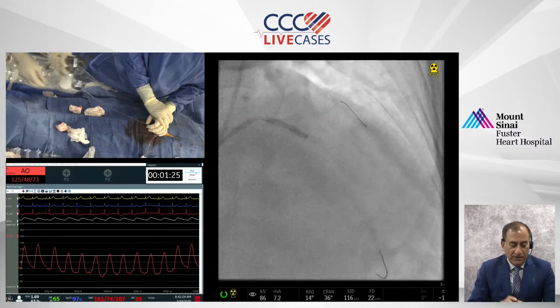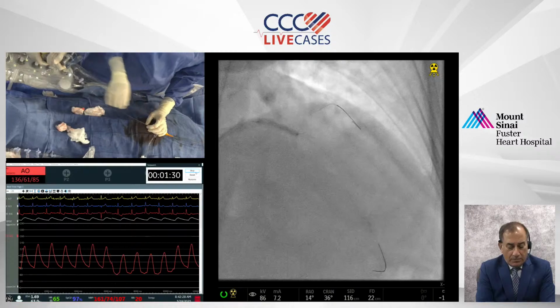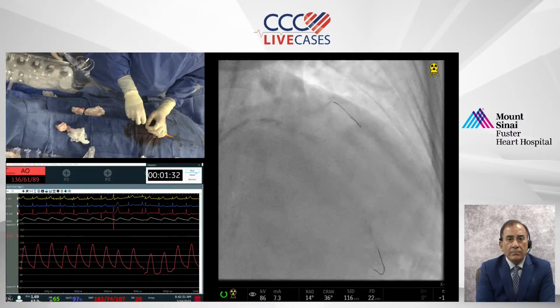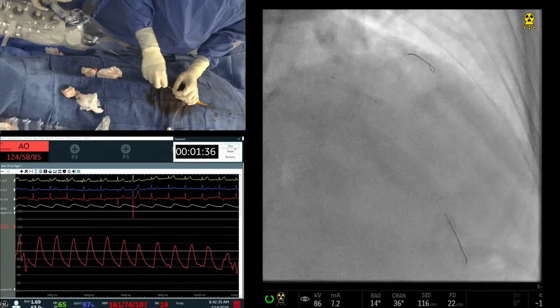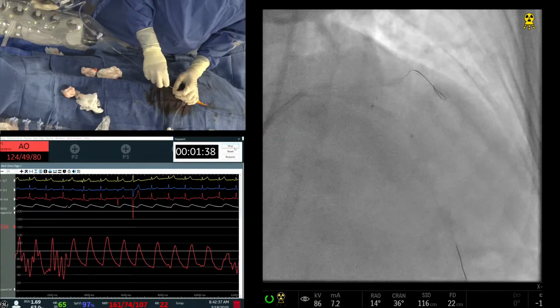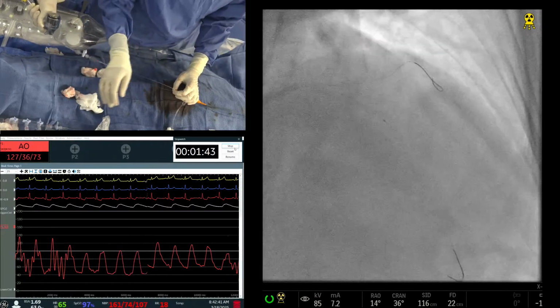Yep. So wonderful. We just recently, our last month, done a very complex right coronary, requires 2 rota bar, 2 IVL, very tough one. He wasn't going to be sending you a simple case, because simple, we want him to take care. Very good, Naveen.